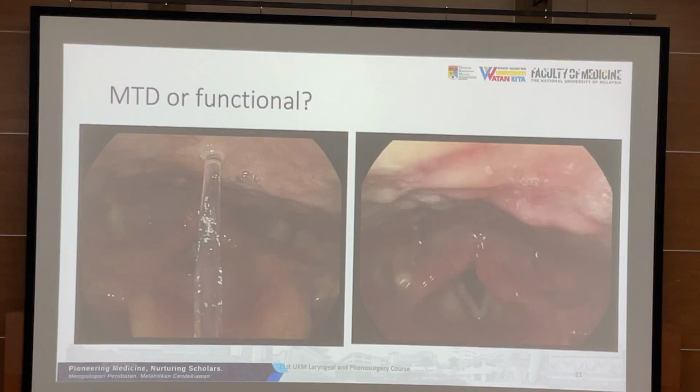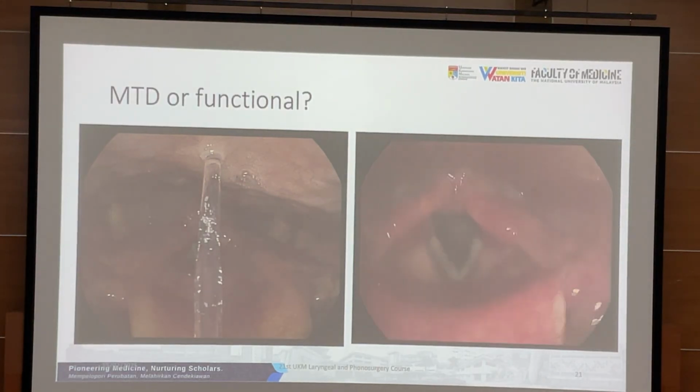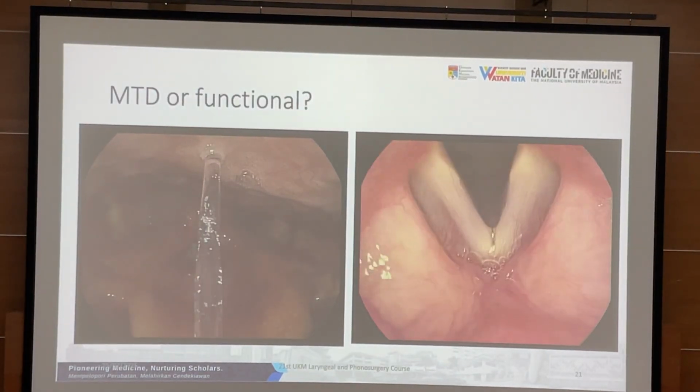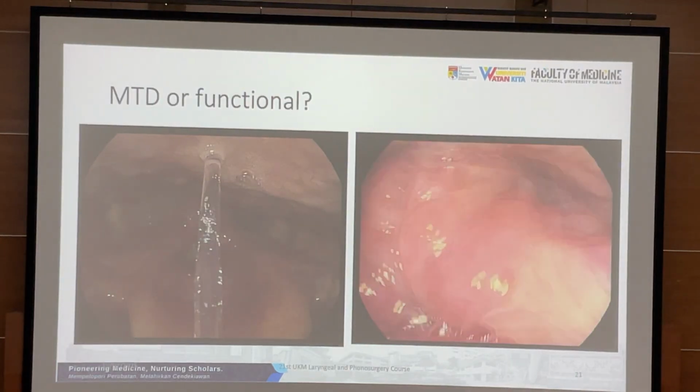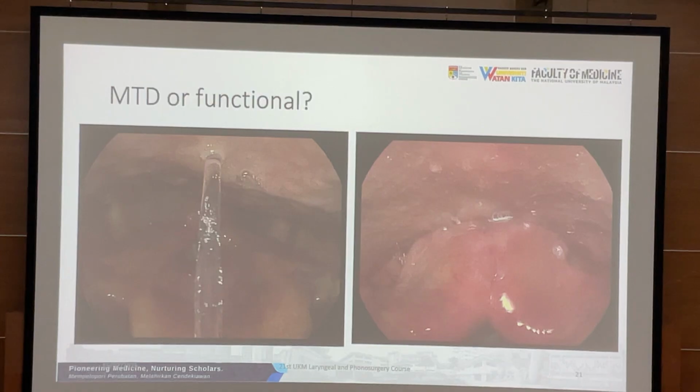The patient is talking. So that is the patient phonating. The voice that you heard, E, is the examiner. It's like, please say E. So E does not belong to the patient. The patient is talking like this.